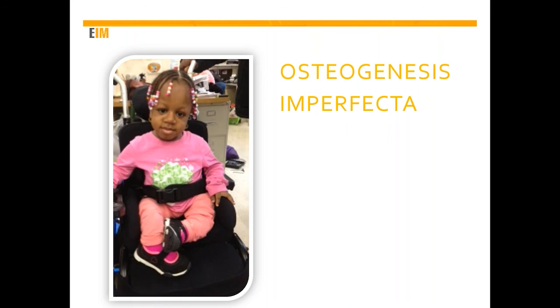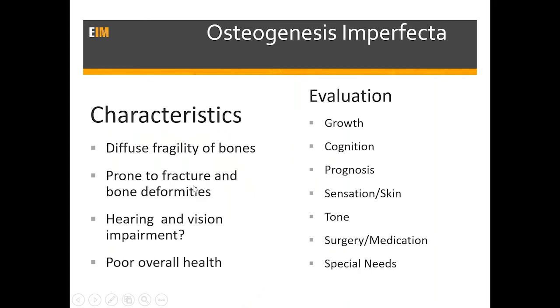Soft, a little foot box here because of her misshapen and short legs. Just a little happy home for her legs to be. She's safe, she's supported, and quite comfortable and mobile.